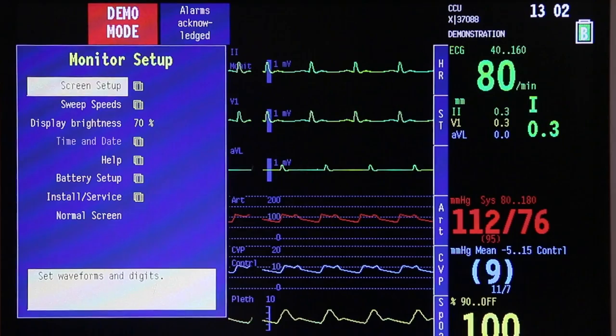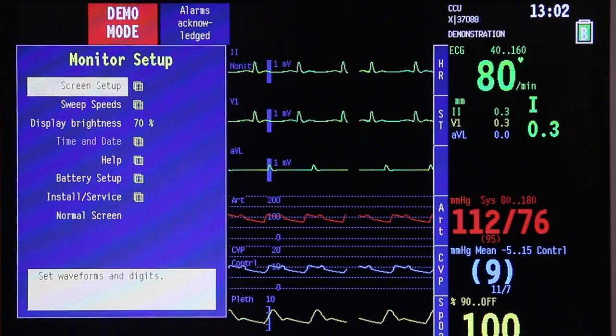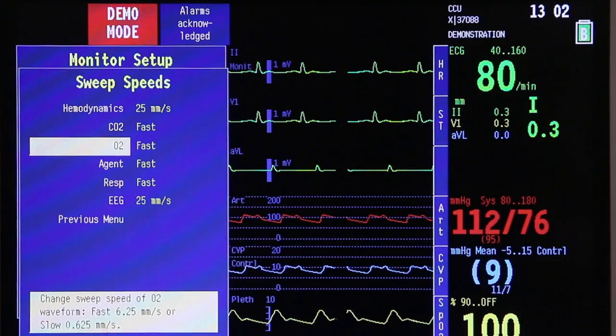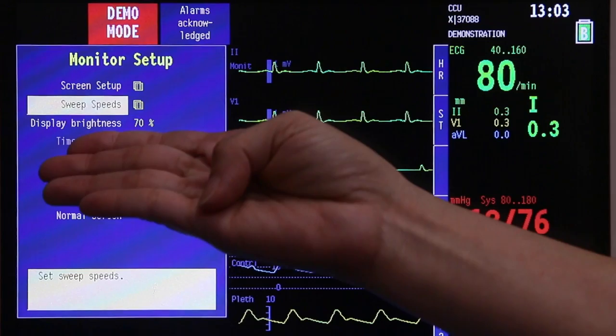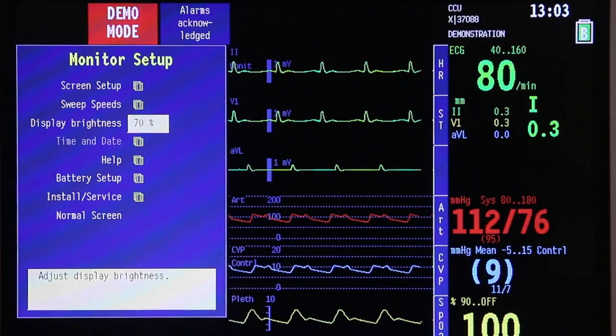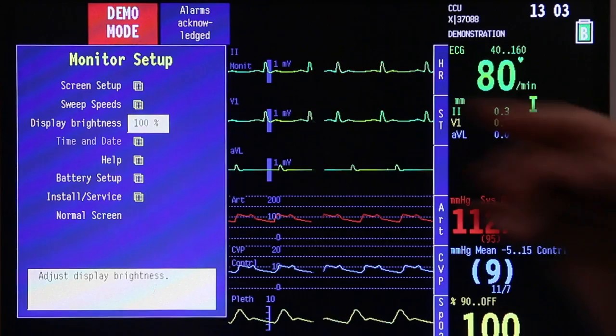Other than screen setup, you have sweep speeds on your screen. If you want to adjust the sweep speed of your waveforms, click sweep speed, press your trim knob once, and then choose the speed that you want. Once done, go back to previous menu. Next is brightness display — currently it is at 70%. If you want to bring it up, scroll down, press once, rotate your trim knob until the desired brightness level, press once, and you are done.